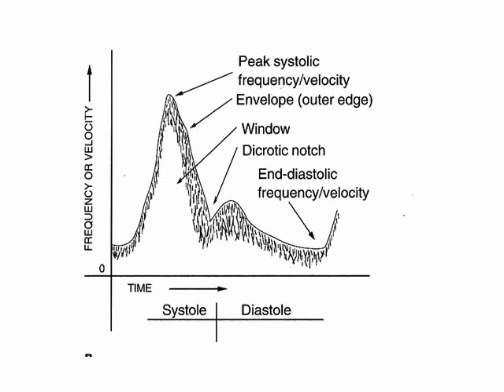The other is the diastole, when the heart relaxes. The peak systolic is the part where velocity is fastest, and occurs in systole. On the contrary, another important one is the end diastolic, because it's the part when the blood is going slow. It is the last part before the new systole.